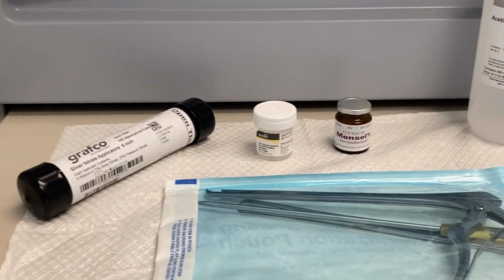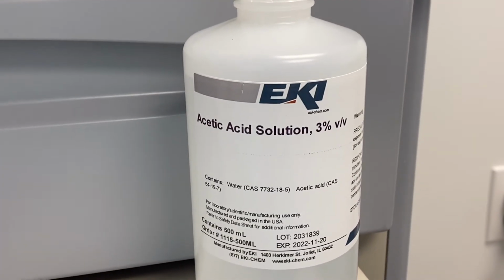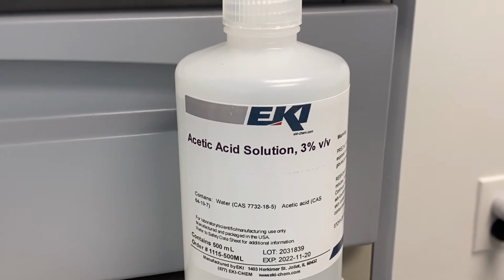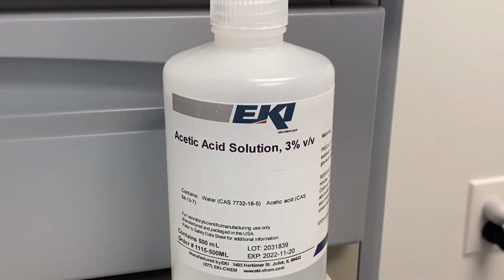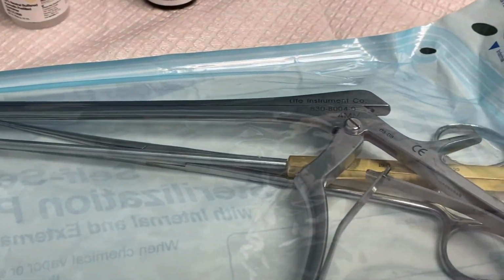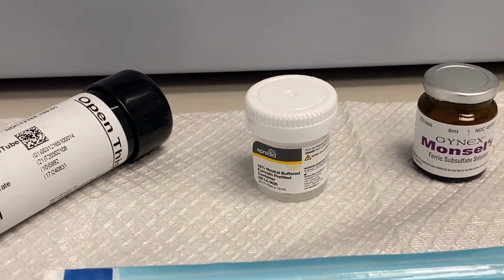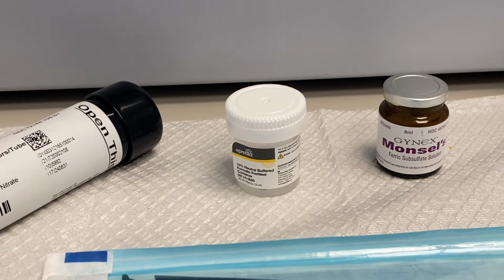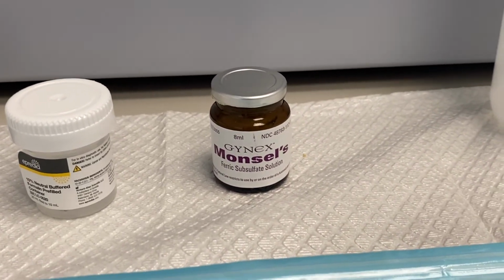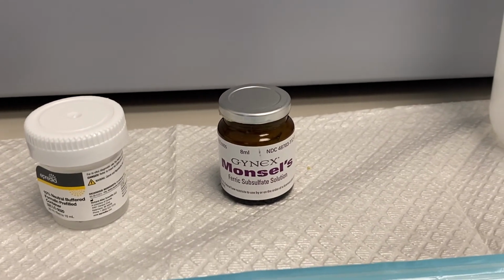These are the instruments that are usually used during a colposcopy. The first thing that is applied is called acetic acid. Acetic acid would allow for the abnormal cells to be visualized using the colposcope because they will light up in white. These would be the biopsy instrument. Once the biopsy is performed, it's placed inside a specimen cup and sent to the lab where the pathology would evaluate it. Once the biopsy is completed, we will usually apply Monsel's solution, which is initially color mustard, but then it becomes coffee color and it minimizes bleeding.